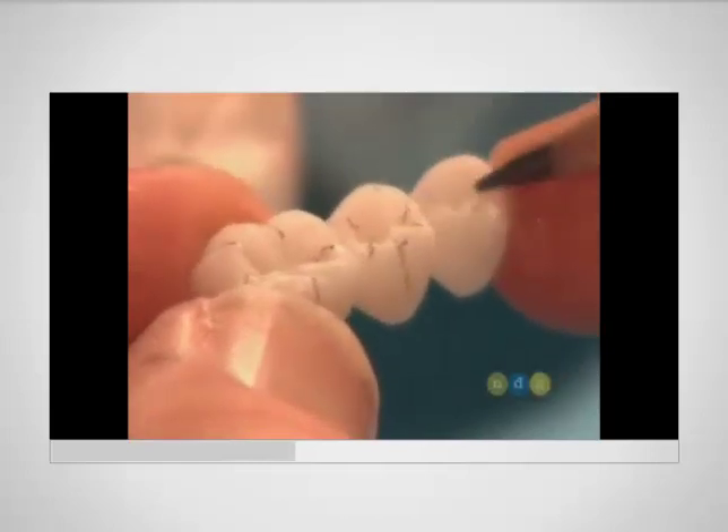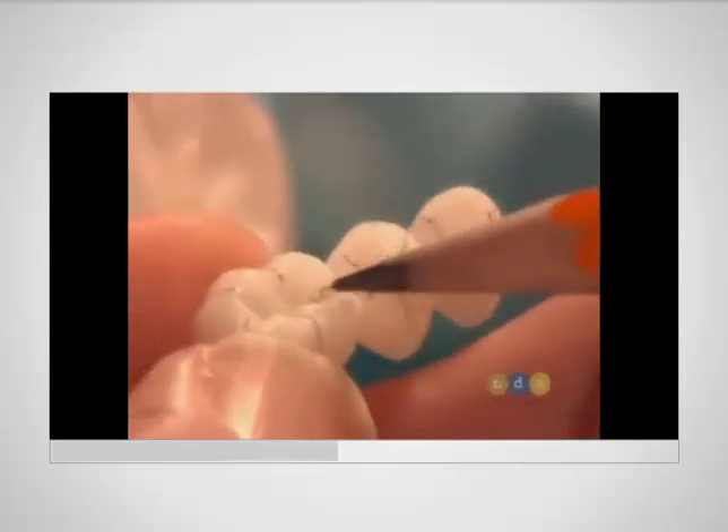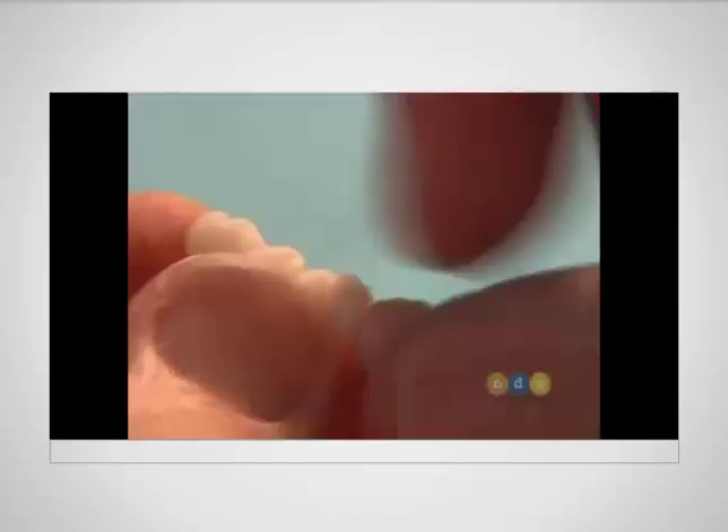You might ask, why this detail on the temporary? Well, my preparation is under here. If I want my final restoration to have that detail, and my preparation is too close, we're going to be showing zirconium or metal through, because there isn't enough thickness to allow for proper contour.